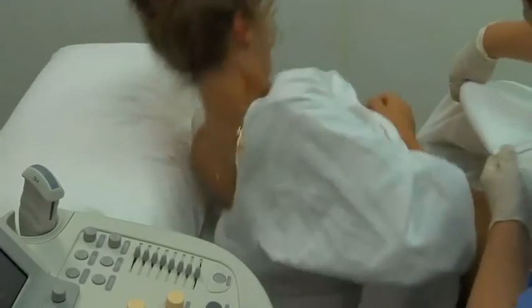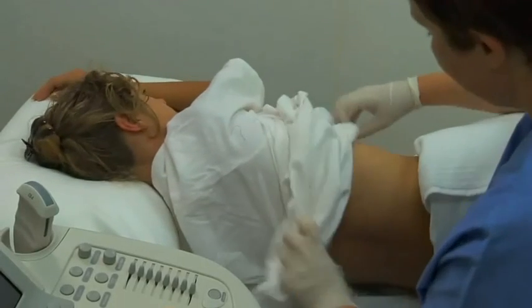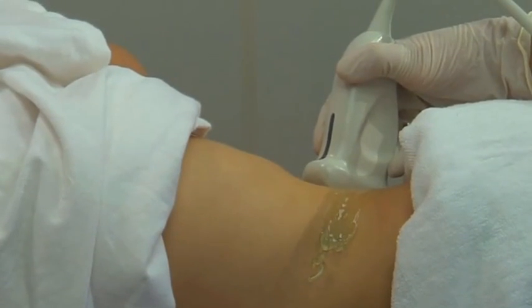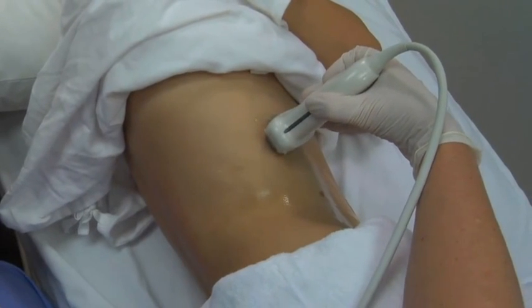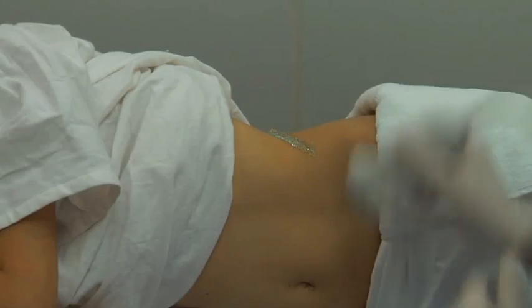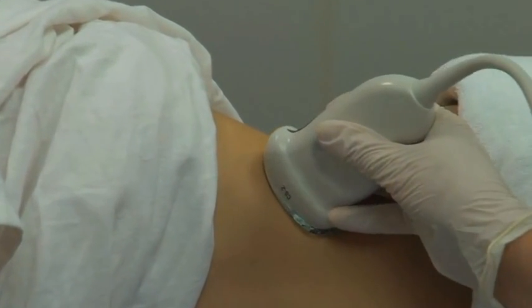If overlying bowel gas obscures the image, the patient position may be varied between lateral decubitus and posterior oblique, and the transducer approach varied from subcostal to intercostal as required. Repeat the steps for scanning the left kidney with the patient in the right lateral decubitus position.